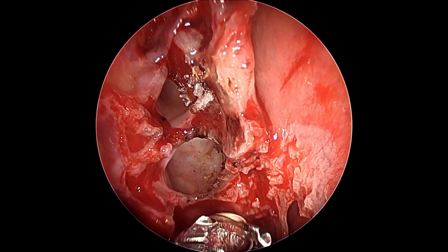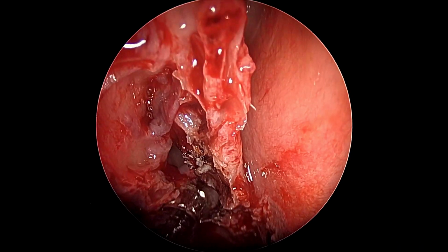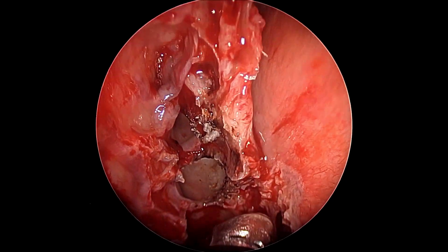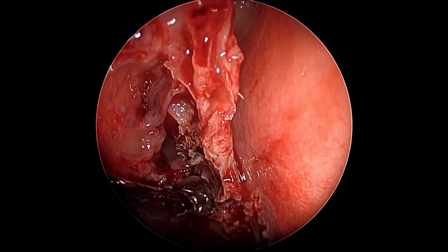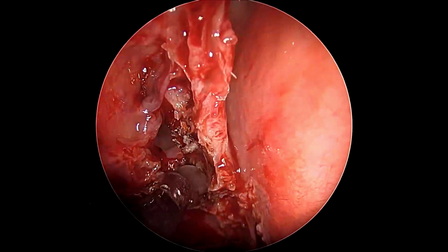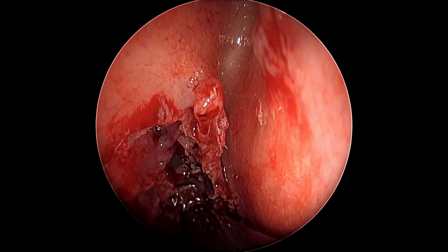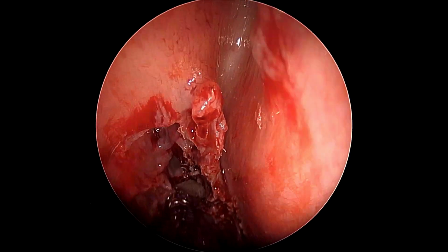Now steps like this might look repetitive and time consuming, but almost the entire part of surgery is basically bed preparation and access in such patients. And once you have made a generous access and prepared the bed for the grafting or the plugging, then merely plugging or putting your reconstruction grafts here is far simpler than to negotiate them between inadequately prepared sites.